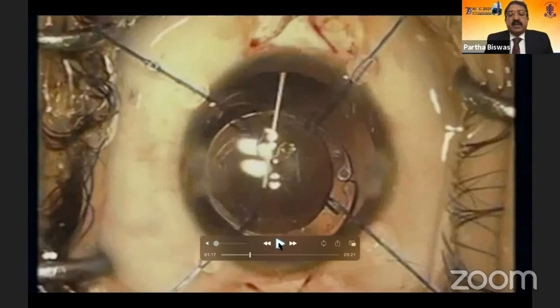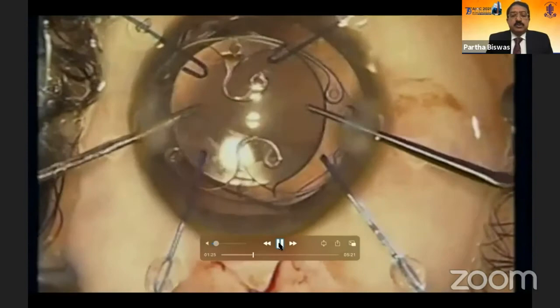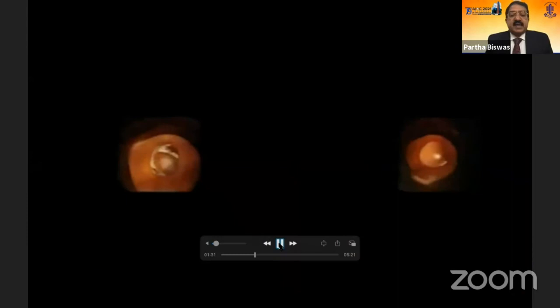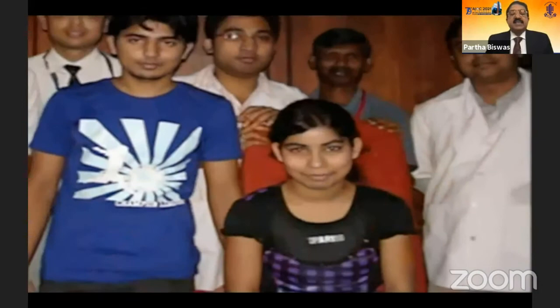The next part, of course, is the more important part. These microspherophakic lenses have deficient zonules, so you have to anchor them and have them in place, optimally done. Once that is done, you have the intraocular lenses in place, the microspherophakic bag fine and in place. If it is in place, the patient actually enjoys very good vision. This is our whole team which looked after this child, and this is her sister who came nearly 6 years later.